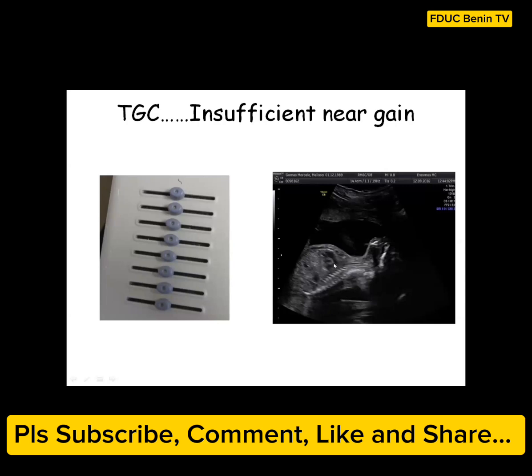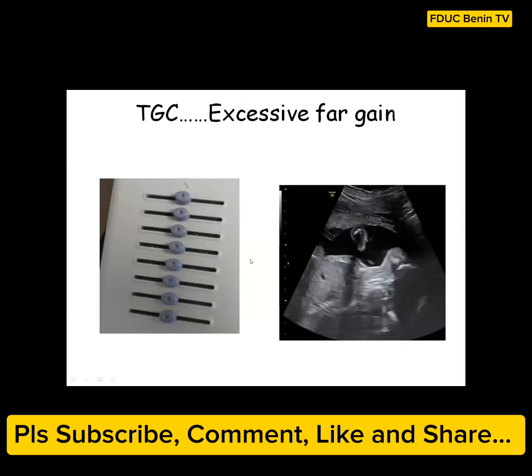So if your area of interest is, for example, in this fetus, around the fetal trunk, then I will adjust the corresponding time gain compensation knob, which is around here. This is the one I will adjust so that the brightness of this area of interest will be optimal for me to see the structures I want to see. I will not adjust these first three or these last three. It's this area of interest, which corresponds to this slider, that I will adjust.